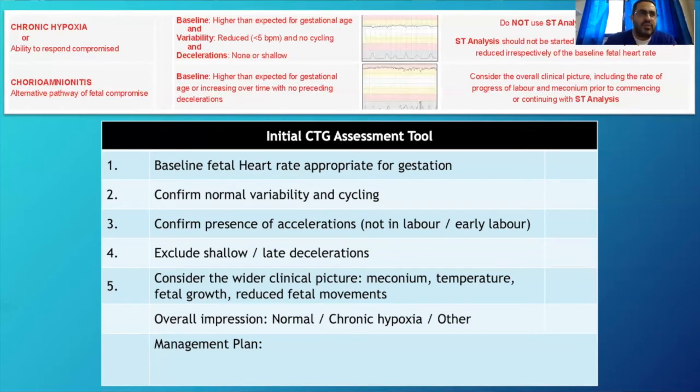If you don't have a previous CTG, look at the antenatal clinic appointments. There's always recorded numbers there. It will tell you where this baby's heart rate was when there was nothing else happening earlier on in pregnancy, and where to expect it now that this baby is older and is actually going through a stress.